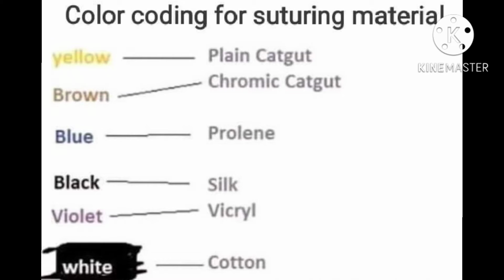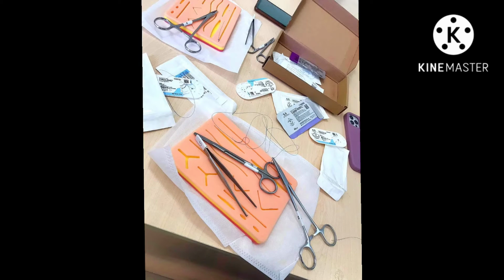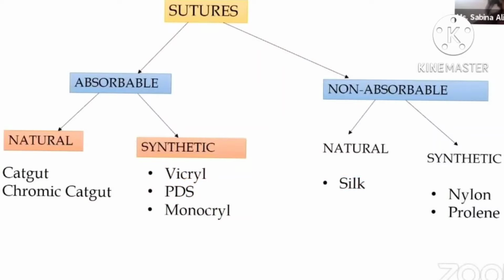Absorbable suture is also used in environments with high crystalloid concentrations that may precipitate stones, like the urinary or biliary tract. According to permanent suture, it is made from various plastics.